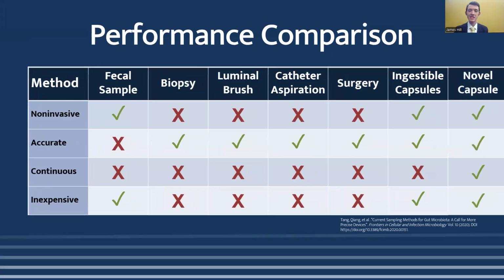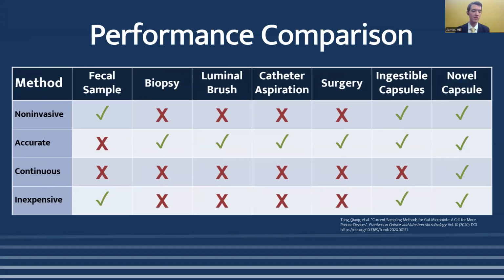The result of all this analysis is that this device has significant potential to fulfill a market void and enable long-term, continuous, and minimally invasive analysis of the gut microbiome. This provides individuals, especially those with anxiety over typical traditional diagnosis methods, with a better knowledge of their own gut health, facilitating more effective treatment strategies and therapies to help these people live their lives without interruption.